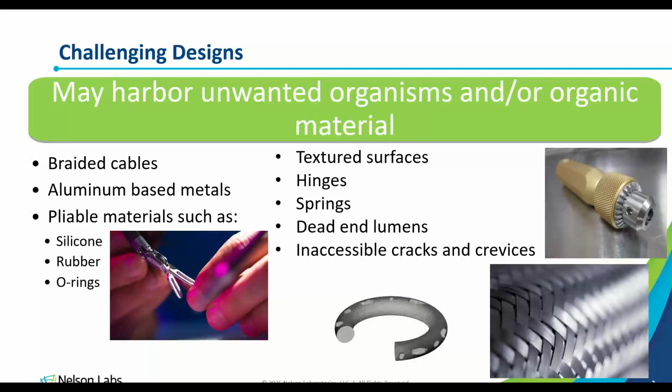70%. So AAMI ST98 and ISO 15883-5 do recommend that the recovery efficiency be above 70%, but it's not a strict requirement. It says something to the effect that recovery efficiencies are generally above 70%. So if it's below 70%, I think that's okay, and it depends on a few things. If you are below 70%, I would do an evaluation of the extraction method used.